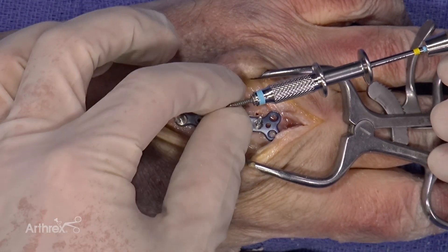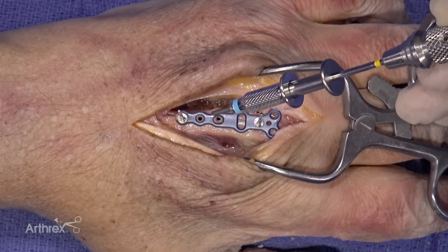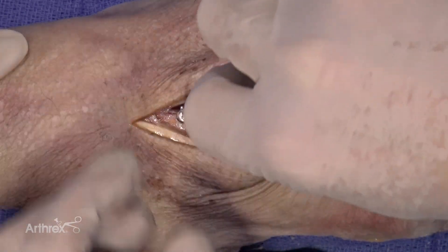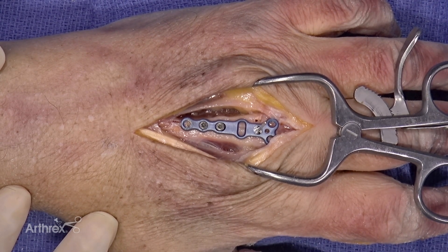It provides a very secure fit between the screw and the screwdriver, and it does not allow the screw to fall off as it's being instrumented into the bone. Now the BB-TAC is removed, and that hole is subsequently drilled, measured, and filled with the appropriate length screw.